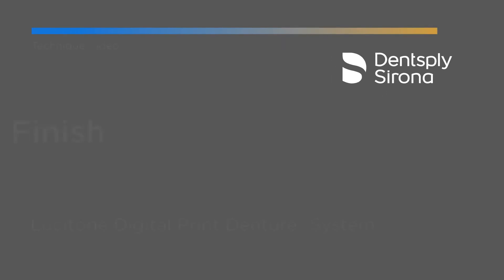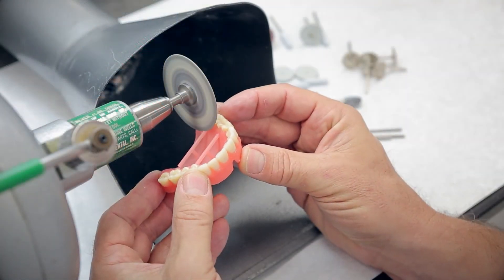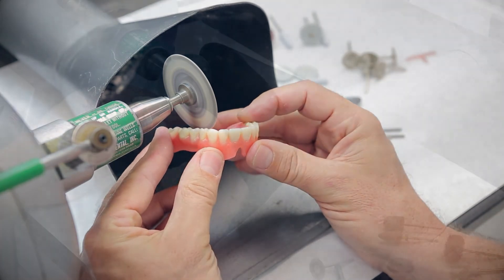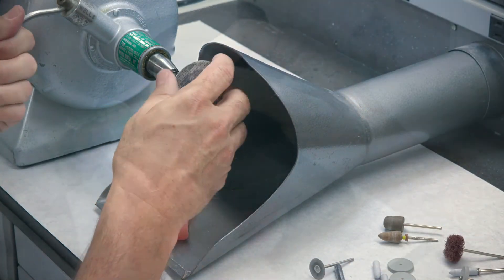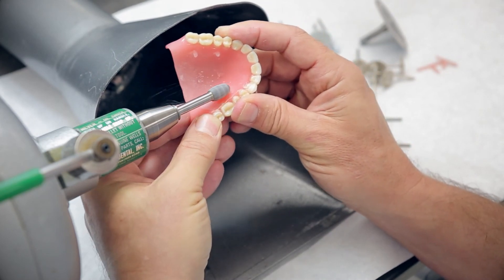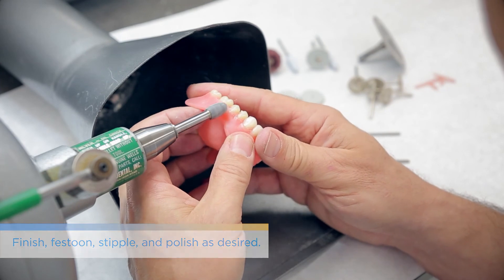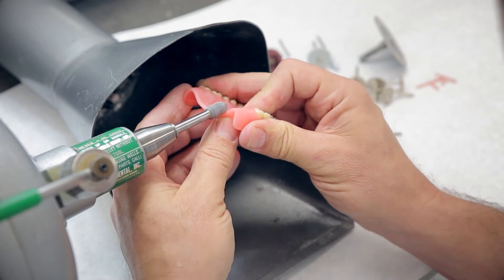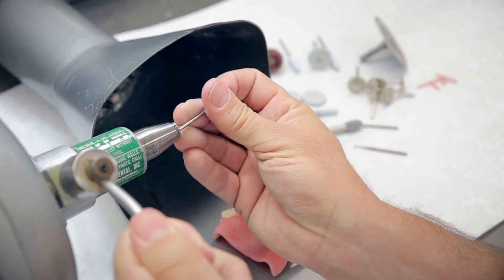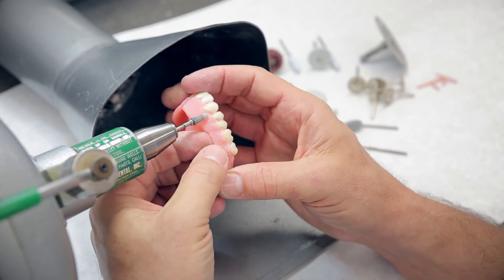Once the dentures are completed in the curing cycle, they're ready for finishing. The nice thing about the Lucitone Digital Print Denture System is that whatever you typically do from an analog perspective, you'll now do for finishing the digital denture. The first thing is removing the support tubes — regardless of what software you designed in, support tubes are always needed for printing to keep the integrity of the entire arch. Remove them at the lab bench and polish off the remaining sprue using a rounded carbide to keep it flush with the palate or lingual aspect of the lower denture. Avoid steam cleaning these, as an important note.